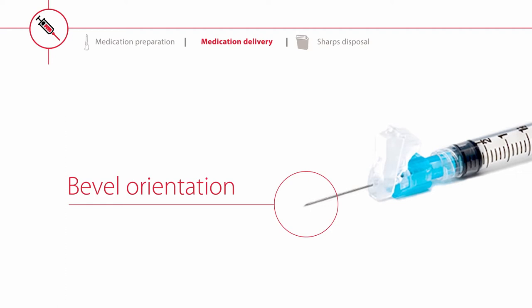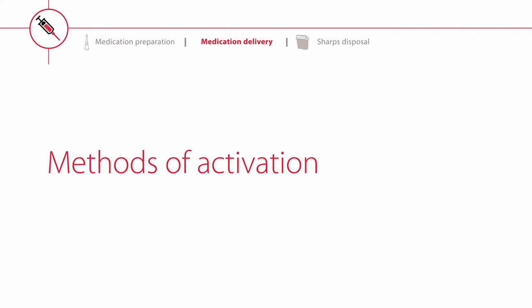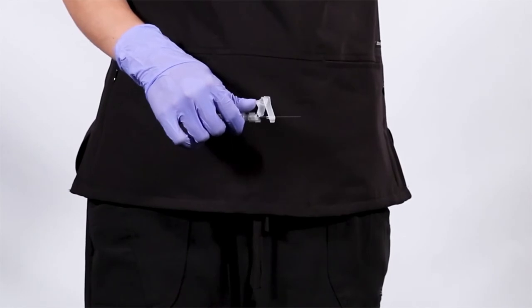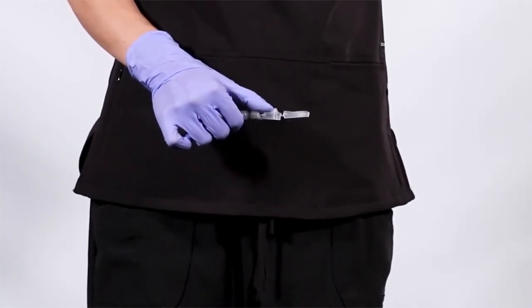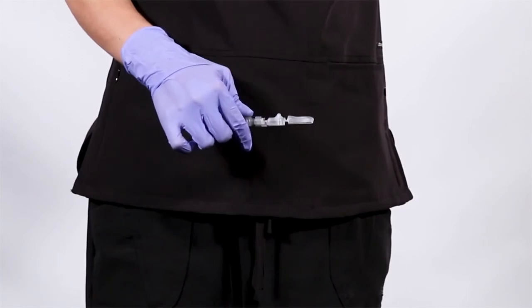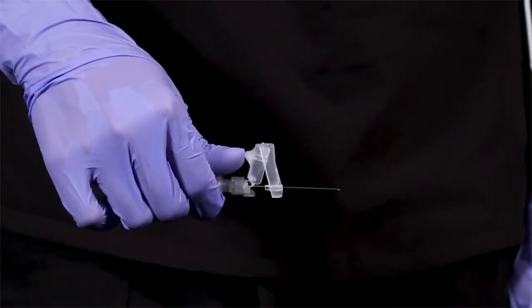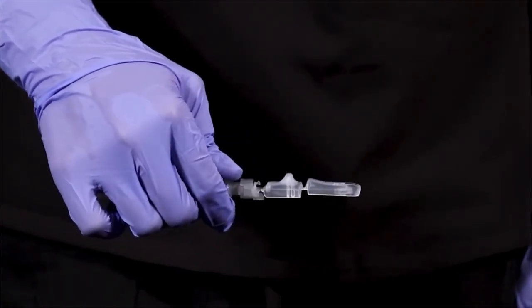Perform the injection following your facility's protocol. There are three methods of activation for the Magellan safety hypodermic needle: thumb, finger, or flat surface. To activate using your thumb, gently push forward on the safety device. Your thumb remains behind the needle at all times. An audible and tactile click will verify that the safety device has been activated to a locked position.